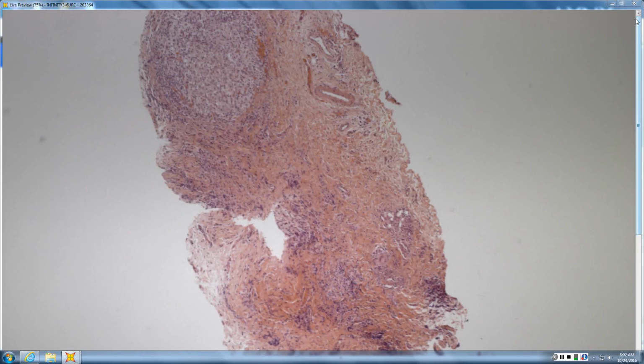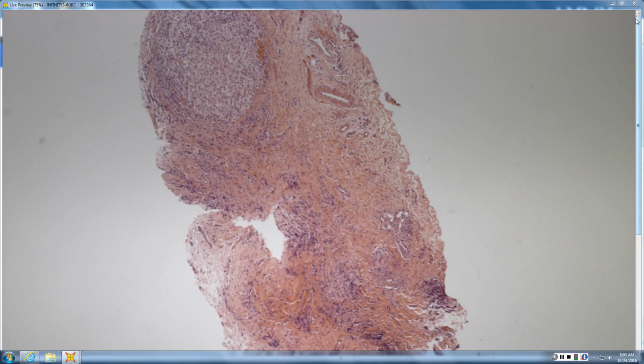What if I told you this was from the lower buccal mucosa on the chin area? So buccal mucosa, sort of lateral to the, actually kind of lower lip on the buccal side, about halfway between the midline and angle of your jaw. Yeah, like a mucocele. Exactly. So, mucoceles, sometimes you see the mucin, sometimes you just see the granuloma. Location and history are kind of key.